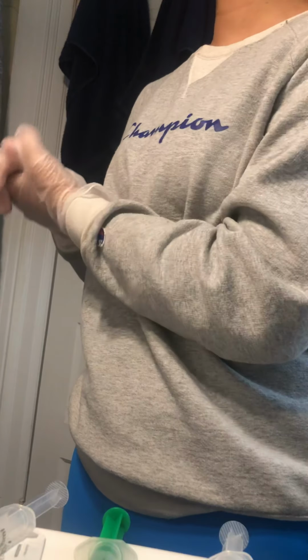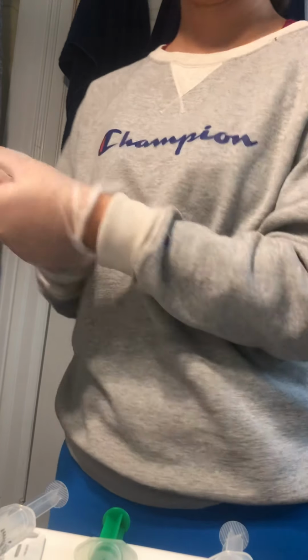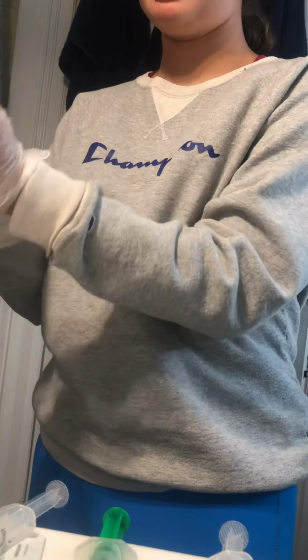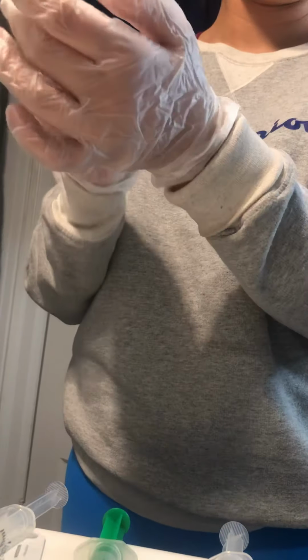We're going to turn off the IV since it's incompatible. So the machine's shut off, which means the D5 half normal saline is stopped. Our site looks good. We're ready for the first flush.